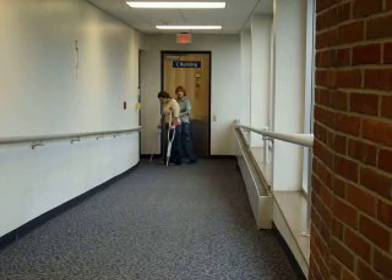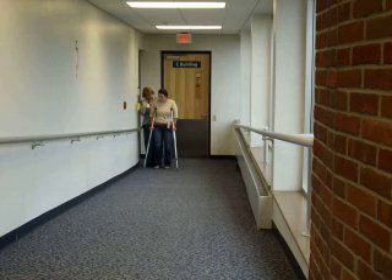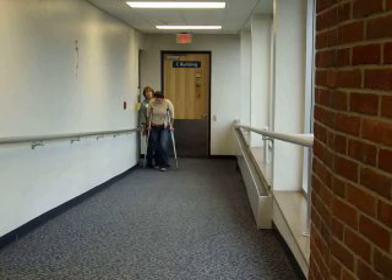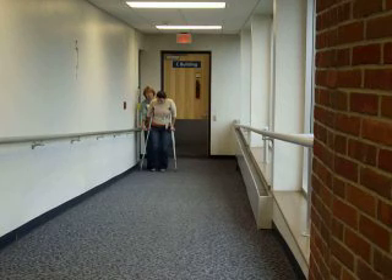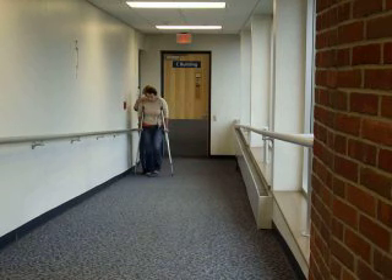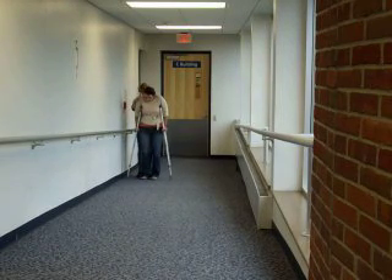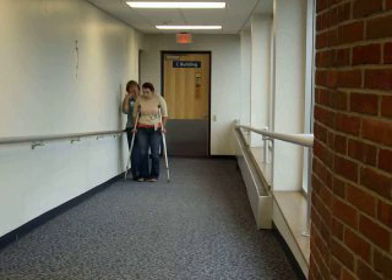If she were already progressed, then it's okay to do that progression. Coming up — for the patient, this is going to be easiest if you picture the ramp as going to be stairs. So when you went up the stairs, you went up with your strong leg first — just do that. Your strong leg forward, and that leaves her weak foot protected between the two crutches. Then bring your weak foot up, and the weak foot is protected by the other foot as you're bringing the crutches up. Strong foot, weak foot, up. And if she's doing fine with that, we could do progressions; if she's having problems, we could do the regressions we talked about.